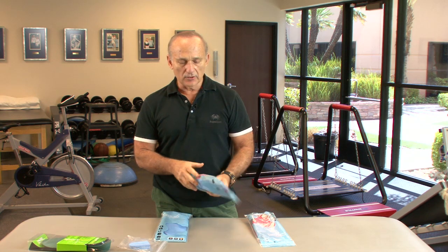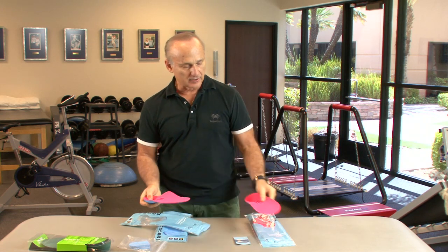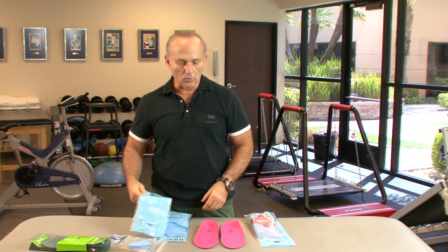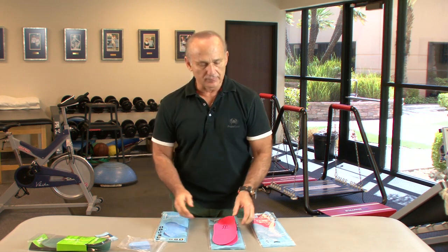Then the last one that I use is a combination, a dual density. You can actually see it has a blue and red, a little bit of this, a little bit of this. These orthotics I use for my less active patients that are just maybe walking a lot in their daily activities. They might play some sports on the weekends, but not aggressively running, cutting, and jumping type sports. So these are the 3 products that I use the most, and I've seen these really help reduce symptoms in the whole lower kinetic chain.